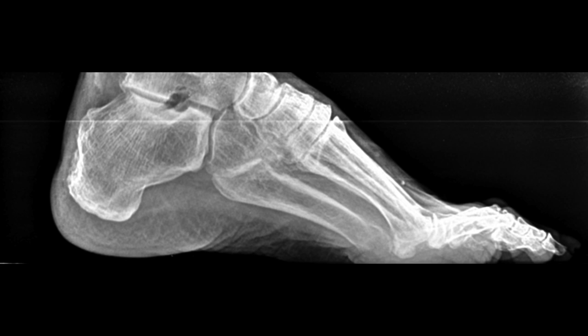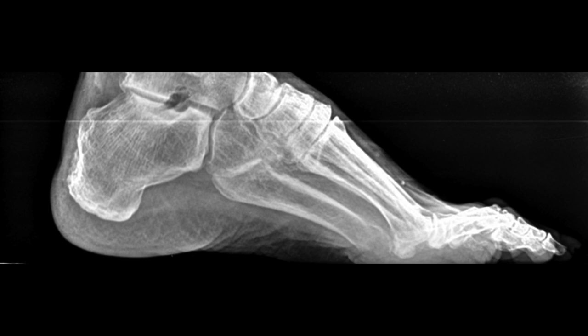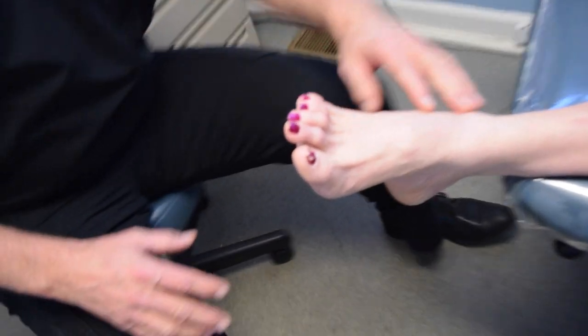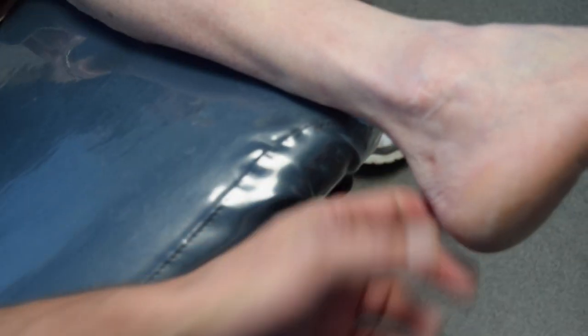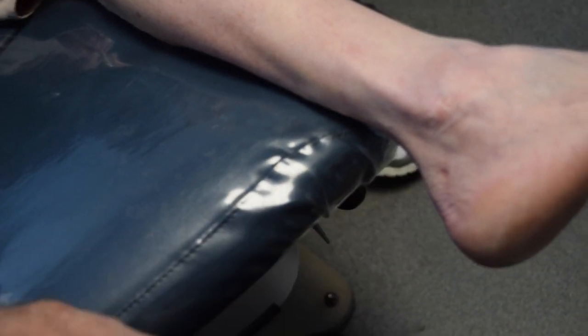The osteotomy actually took a little more bone than what you can appreciate from the fluoroscopy. Now we're going to let the patient talk about her pain and how much better she is. Her foot now — if you look here — is much more improved. She doesn't have the big bump she had before.